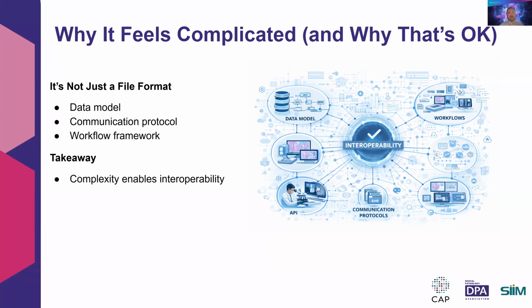So why it feels complicated, and why that's okay. If it sounds complicated, that's because it is. It's not just a file format, it's a data model, it's a communication protocol, it's a workflow framework. And in pathology, we're essentially adapting something that was developed for radiology and adding to the standard so that it accommodates our pathology images. That complexity is a trade-off for standardization, interoperability, and future proofing.